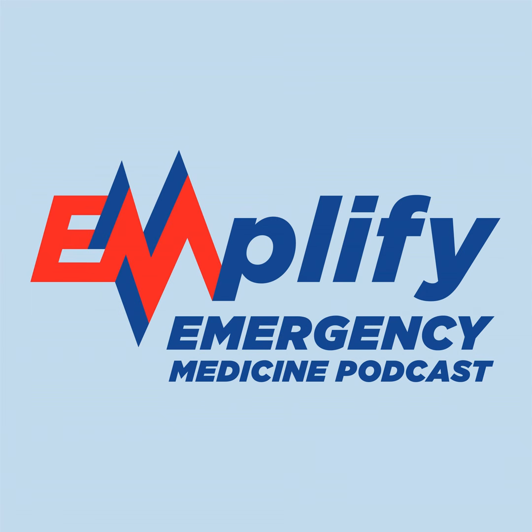However, you can also have assist breaths where the patient triggers a breath by starting to inhale. And once it reaches a certain threshold, it's noticed that your patient is trying to overbreathe, and then it will deliver an assist breath. This assist breath will be the same as the tidal volume that you have set because it is a volume assist control mode.